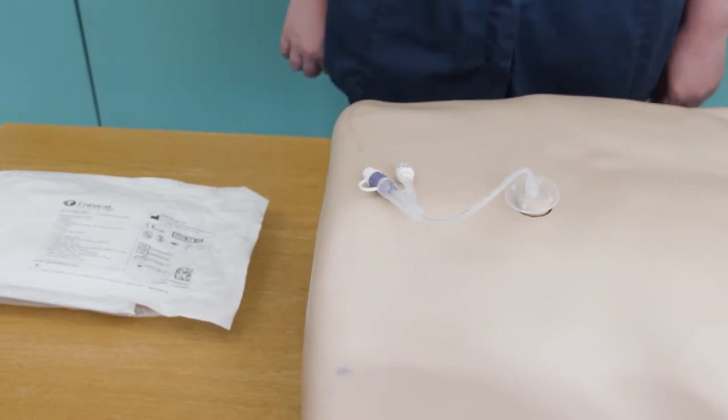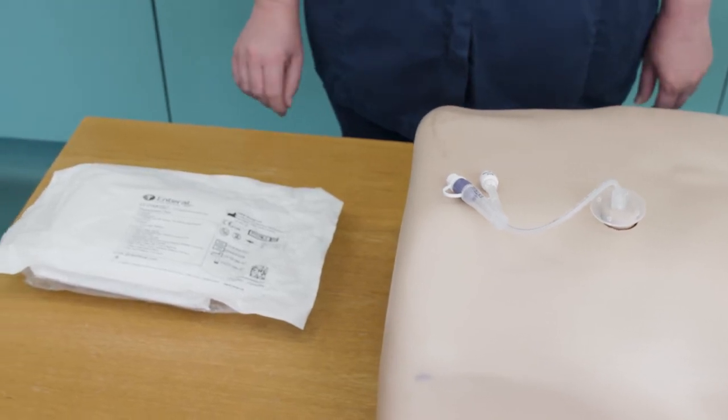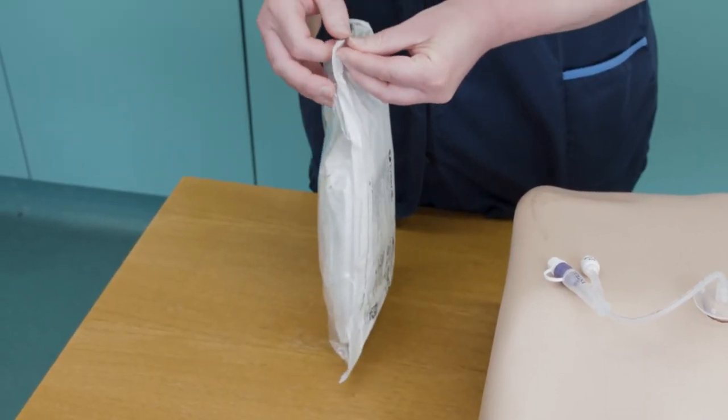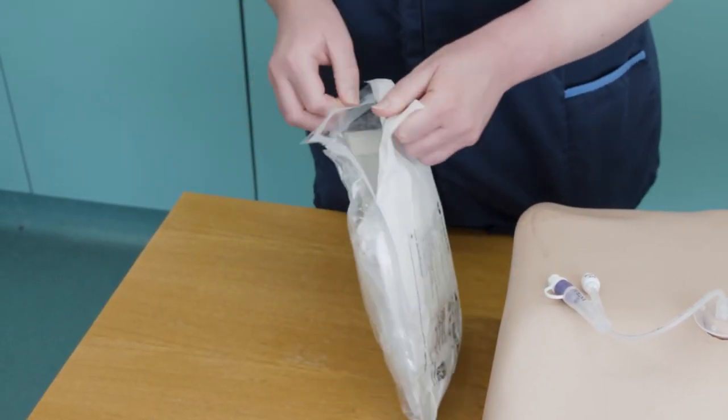Wash your hands for 20 seconds and put on gloves and apron once you have opened the gastrostomy pack, first checking that the condition of the packaging and use by date is correct.